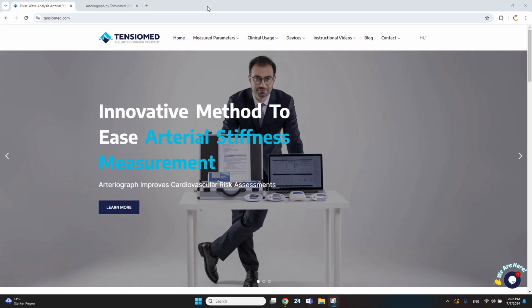Hello, my name is Olin Johansson and I am part of the TensioMed team. In this video I will show you how to download the Arteriograph software, connect the Arteriograph device to your Windows computer, use the Arteriograph software, and perform measurements on a patient.